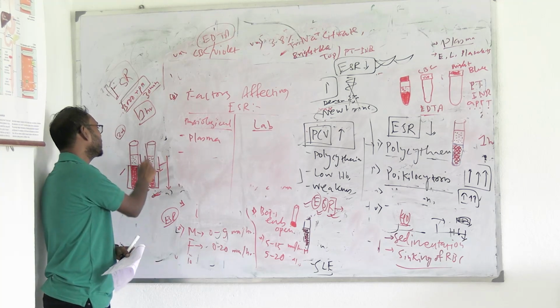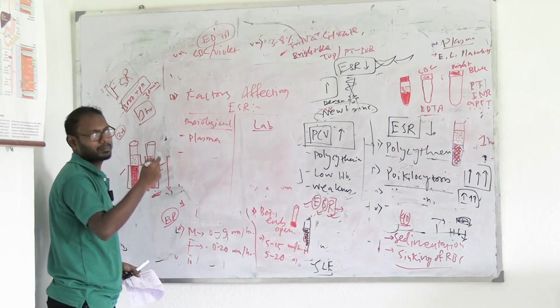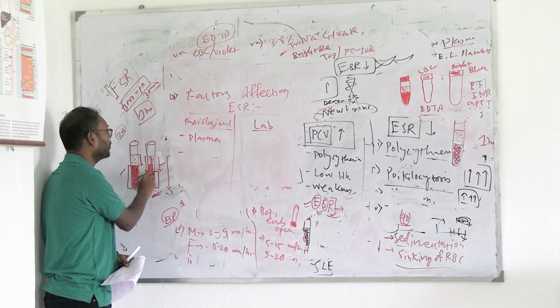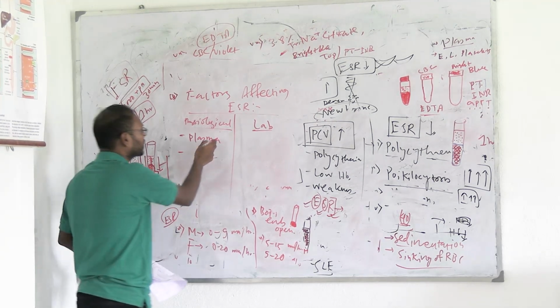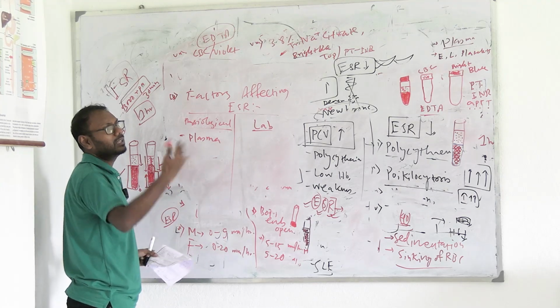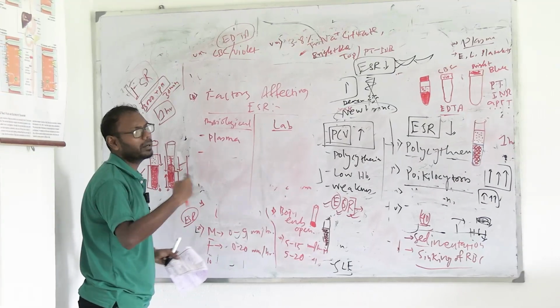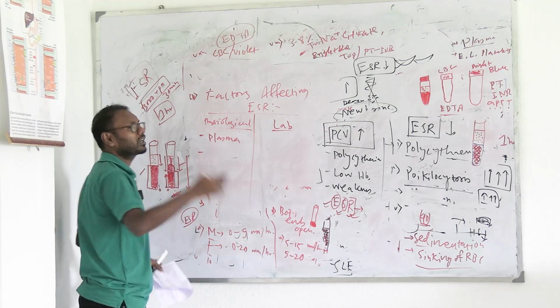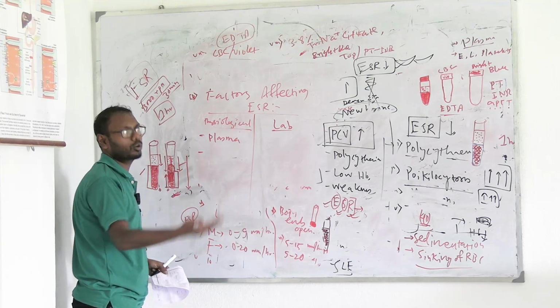Okay, because this level will be greater. If the plasma level is low, definitely ESR will be low. Plasma low hole ki hobe, packed cell will take up more spaces, right? So plasma definitely affects physiological factors. Now if the person is pregnant, when the woman becomes normal, after the baby is delivered, her plasma levels will come back to normal, ESR will be again normal, right?